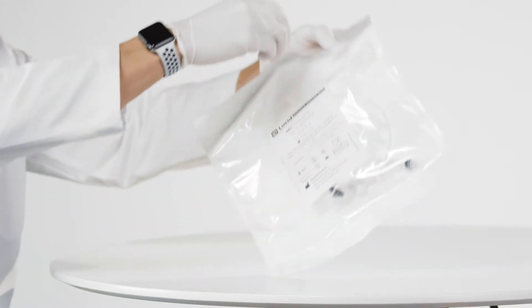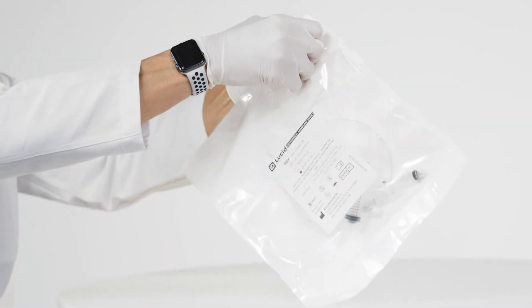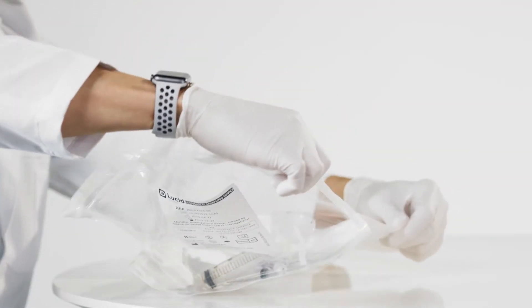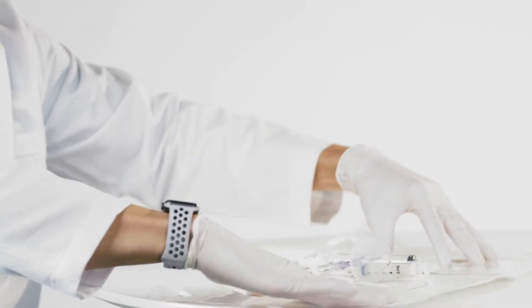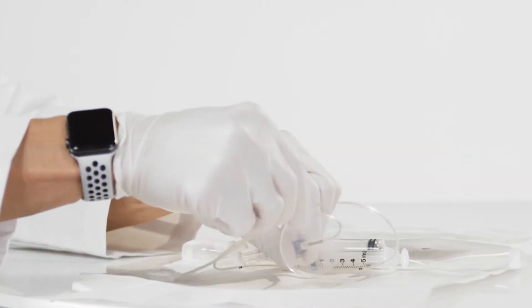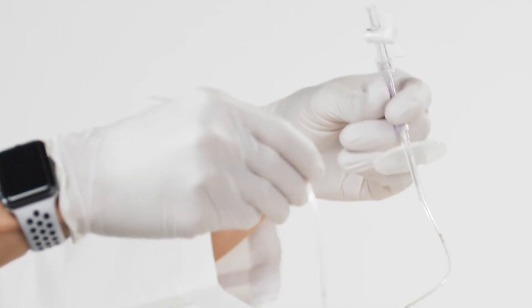Begin by preparing the ESOCHECK device. Open the product pouch containing the coiled catheter, balloon capsule, and two syringes. Tear away the paper tab and discard. Inspect the contents to ensure they are intact and without damage.